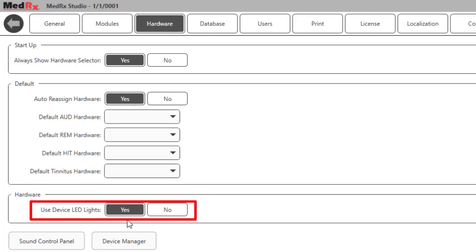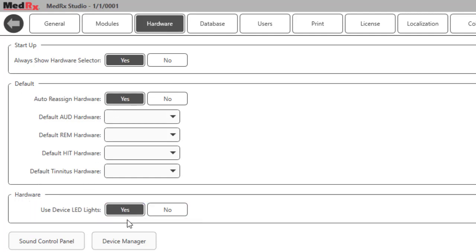You can turn this option off so that the LED will always remain green when the hardware is connected. When this option is changed to no, the LED lights will not change when an ear is selected. This option is typically changed if a patient can see the hardware and can see the colors change when an ear is selected and then attempt to anticipate which ear is being tested.